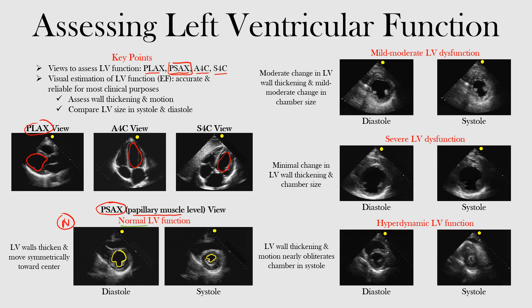Now let's look at mild to moderate LV dysfunction. Again we're comparing diastole and systole. Here there is a moderate change in LV wall thickening and a mild to moderate change in chamber size. Notice that in the parasternal short axis view at the papillary muscle level, the chamber does collapse a little bit in systole, but not as much as in the normal example. This is mild to moderate LV dysfunction — it requires practice to eyeball correctly.